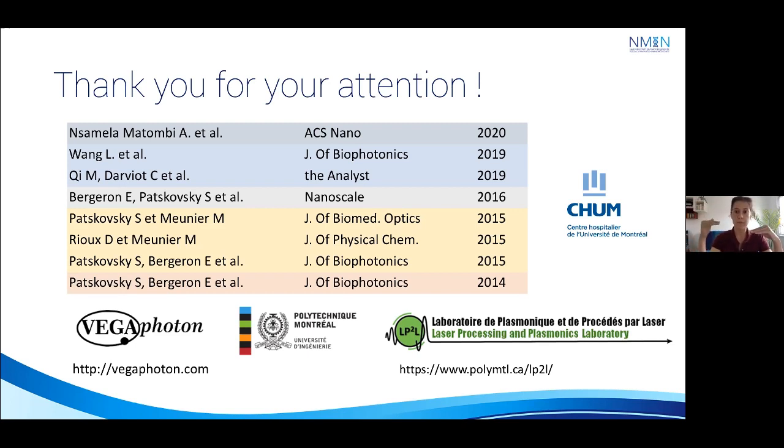So that's why, in some applications, I'm thinking in lung cancer and PD-L1 detection, for instance, in non-small cell lung cancer, PD-L1 can be expressed by various types of cells, but the impact of this expression will not be the same on whether or not the patient is eligible for some treatment. So that's why it's really important to identify both the type of cell and the marker that we're interested in.